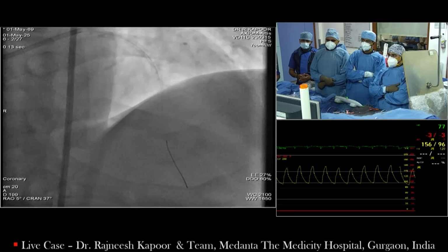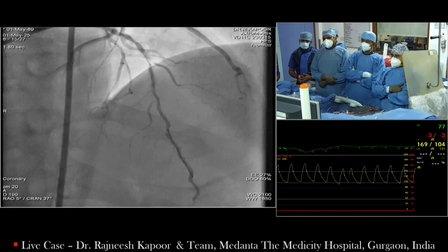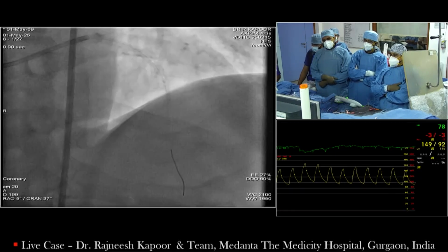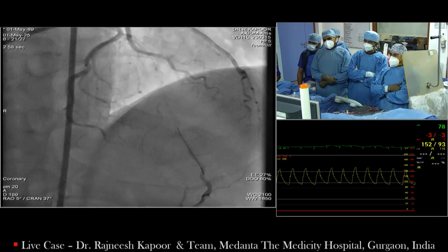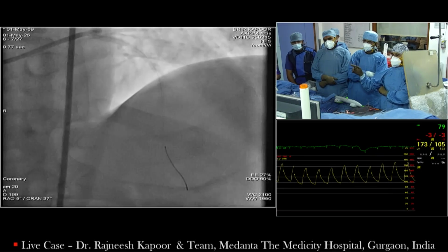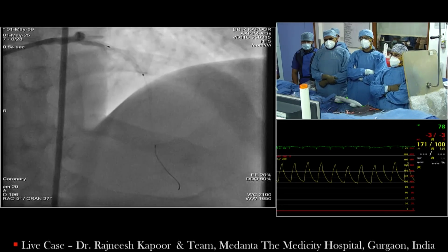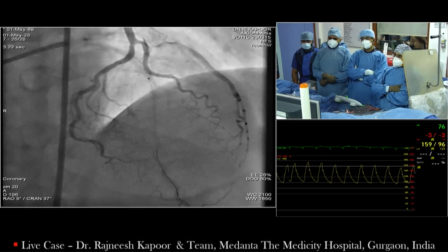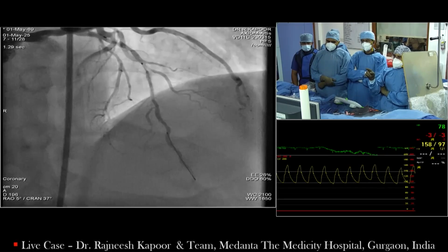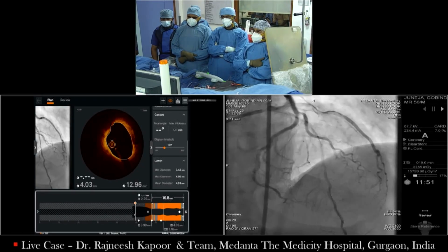And after this, we attempted OCT without any predilatation. We thought if it goes, we'll have a clear picture without disturbing the LAD, but we could only take the OCT around that septal. So it's a heavily calcified vessel. Next. This was the farthest, this is the OCT, and we could reach this point only. It was not going beyond that point, and the reason is very clear. That distal marker of the OCT is at the point of the maximum tightest lesion. So it was not crossing that point.